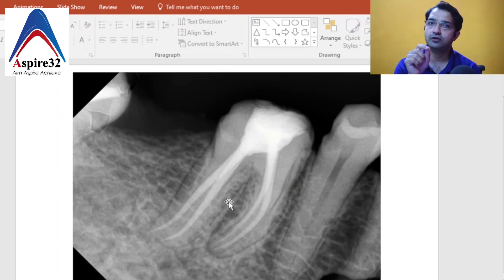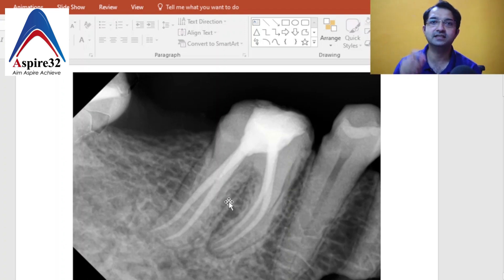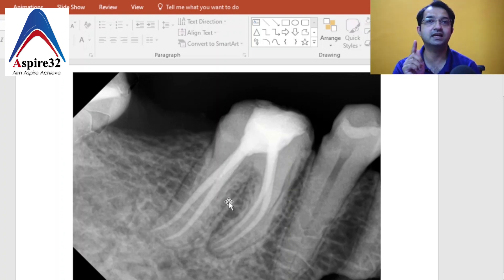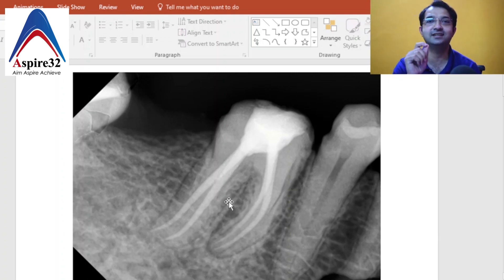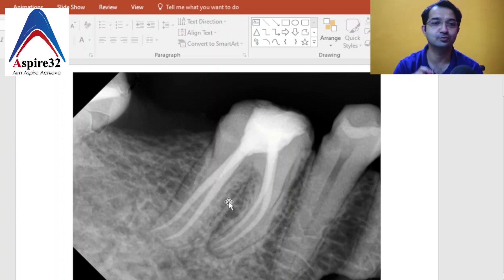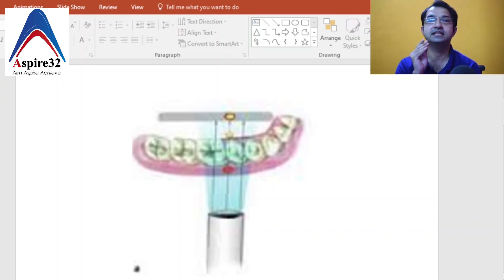Take the mesial root — identifying the mesio-buccal and mesio-lingual is very difficult. This confusion also arises when taking working lengths. When I was a student, people used to tell me to put a K-file in one canal and an H-file in another to identify them. I did that for a few months, and then I came across a rule which makes it really simple to identify canal locations.